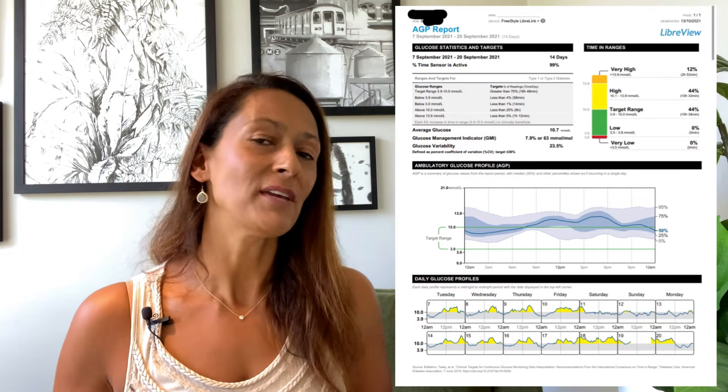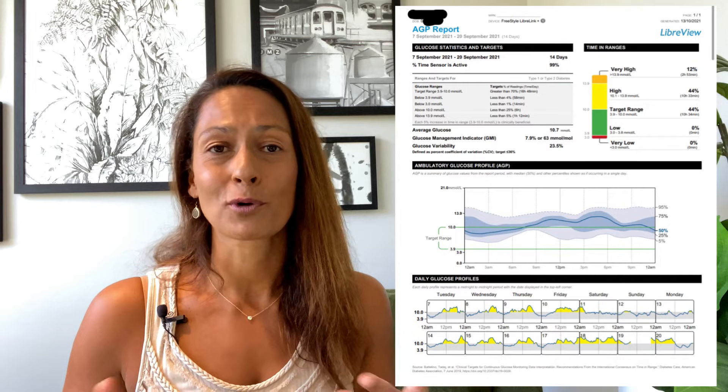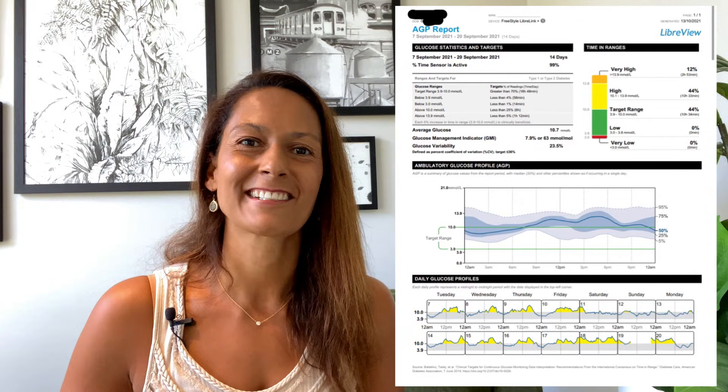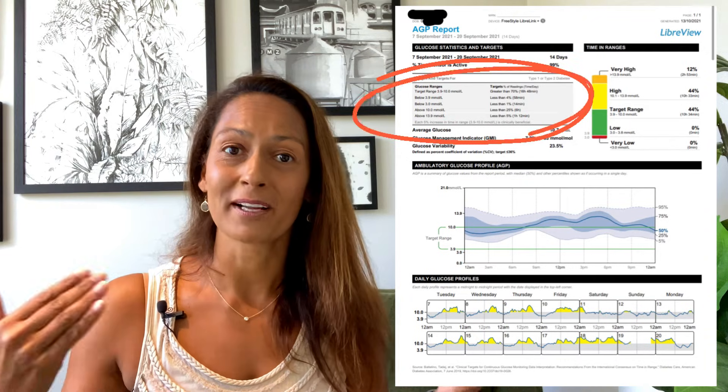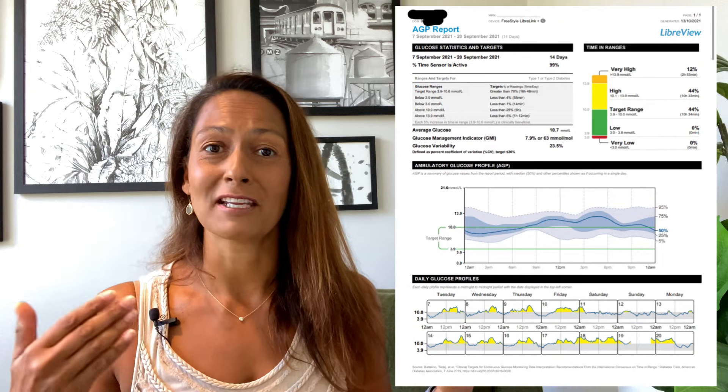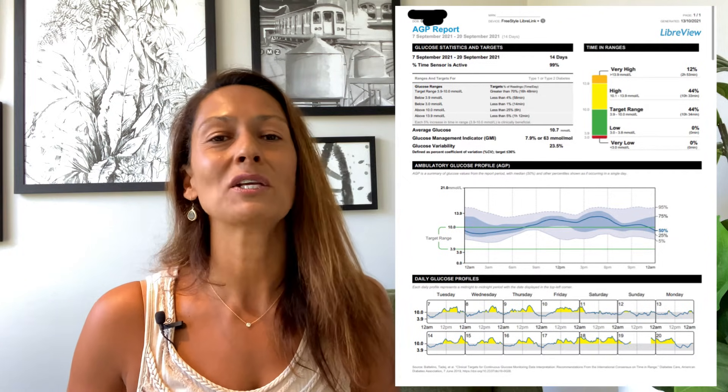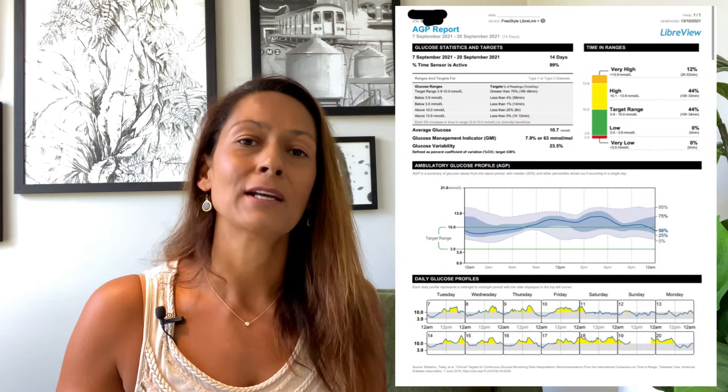Now let's dig in. One of my coaching clients allowed me to share her report — I crossed out her name and date of birth so it's completely anonymous. This is a great example of what you can see in a Libre report, and it's also an excellent example of how much you can get out of paying attention to your data. We want to start on page one, which is the AGP report — the Ambulatory Glucose Profile. This report is in millimoles per liter because this client lives in Australia.